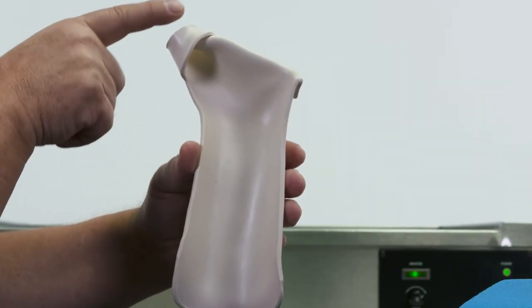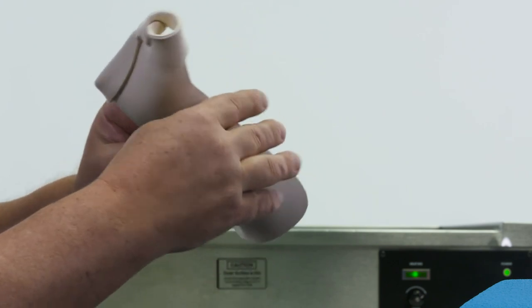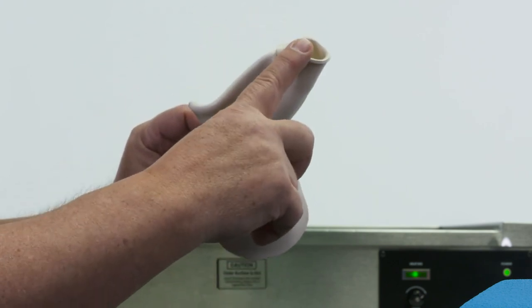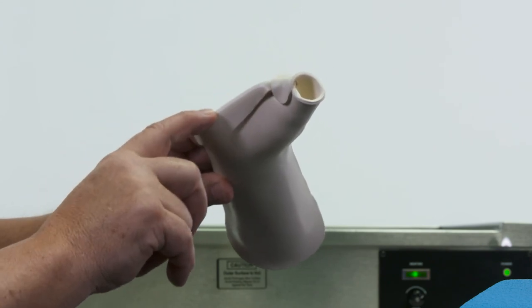The splint should be longer on the radial side than on the ulnar side. The splint should be higher on the radial side than on the ulnar side and there should be an arch reflecting the transverse metacarpal arch.